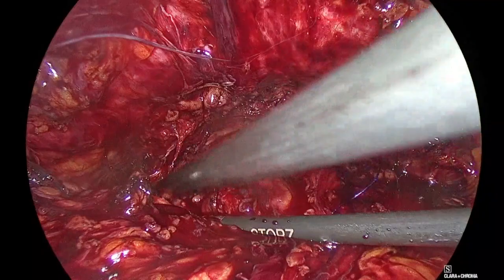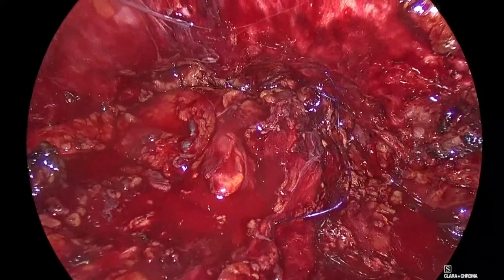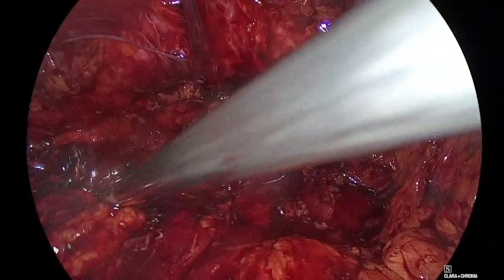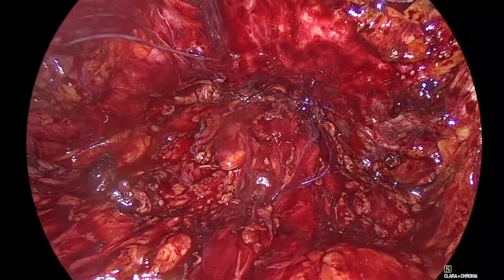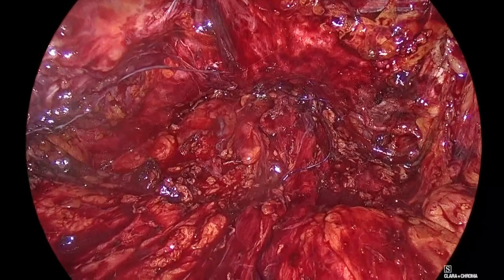Good. So I fill up 20 cc's. I inflate. Oh, this was 10. We put in 20. Good. Let's inflate and see how it is. Good, it's nice and watertight.